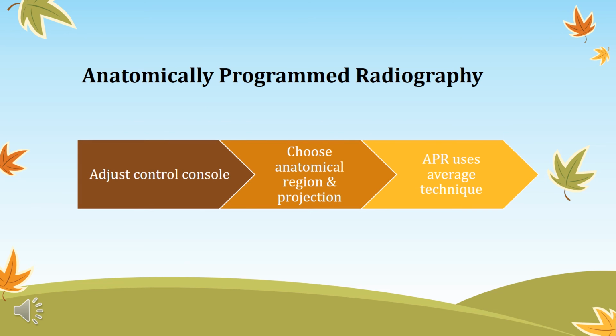Anatomically programmed radiography. There are pre-programmed techniques for any given body part or exam. These are only suggestions for technique and should be customized for each patient.